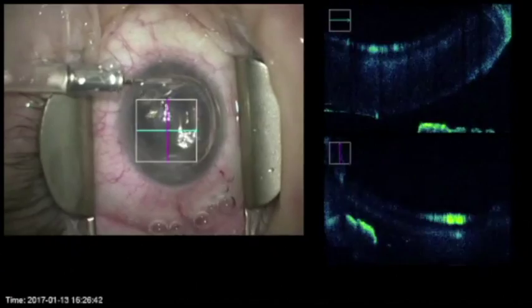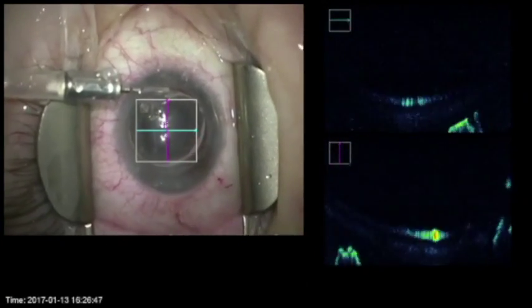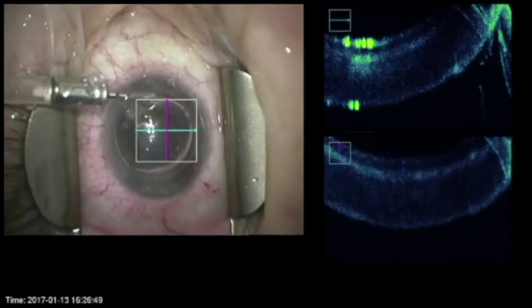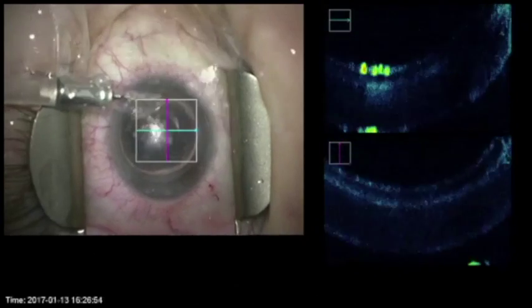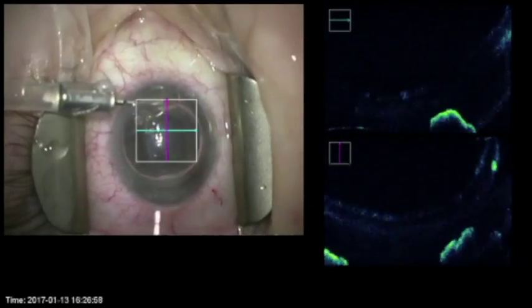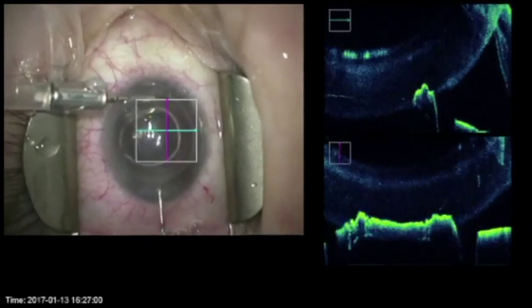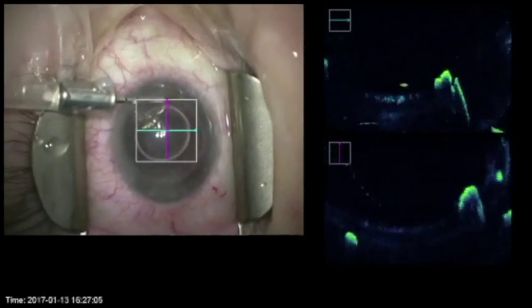Now a bubble is placed under the graft and immediately positions it onto the recipient graft. And with the OCT we can verify that it is in place, which can sometimes be difficult in an eye with previous corneal surgery.